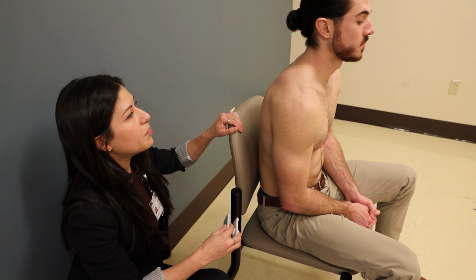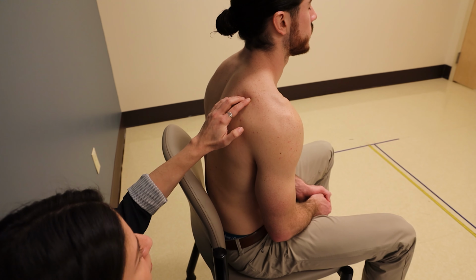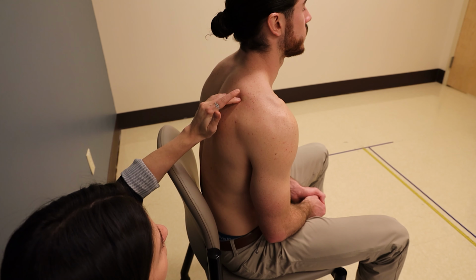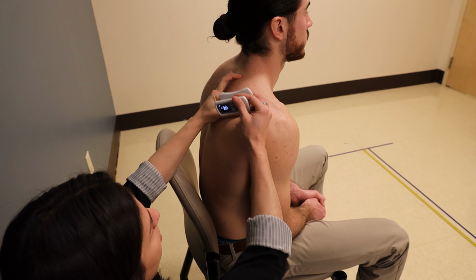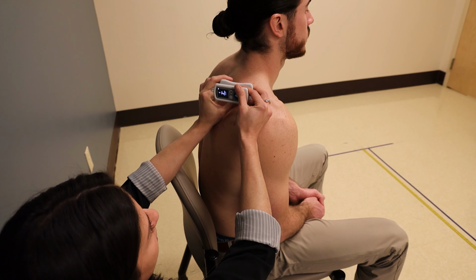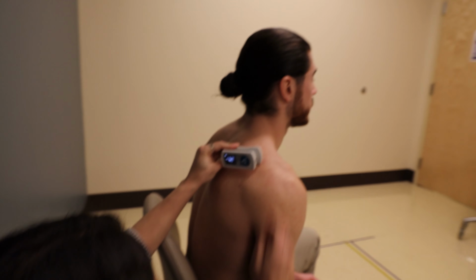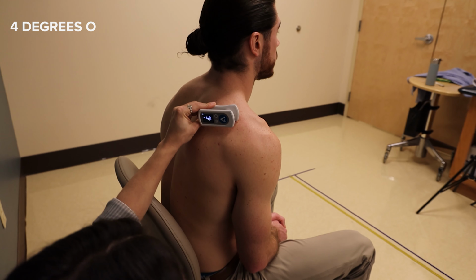Now we're going to come up. We're going to palpate the spine of the scapula because it's the most prominent aspect of the scapula and easiest to palpate. So right there, that's our spine of the scapula. It's a nice little bony area. We use this bottom peg of the Easyangle to approximate with the spine of the scapula. So he's resting in about 4 degrees of upward rotation.